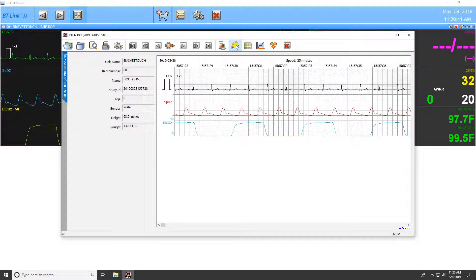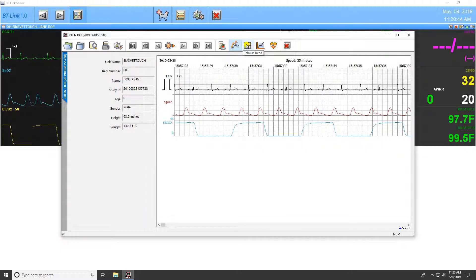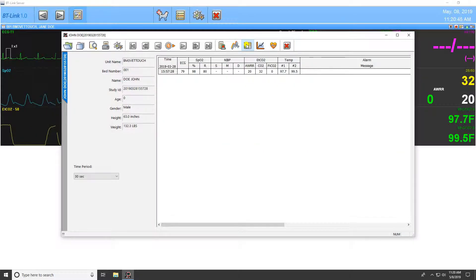The next is the wave view, and is the default view once a study is selected. Next is the tabular trend view for numerical data of the currently selected study.